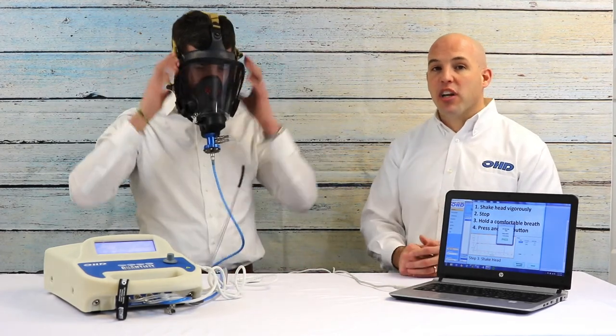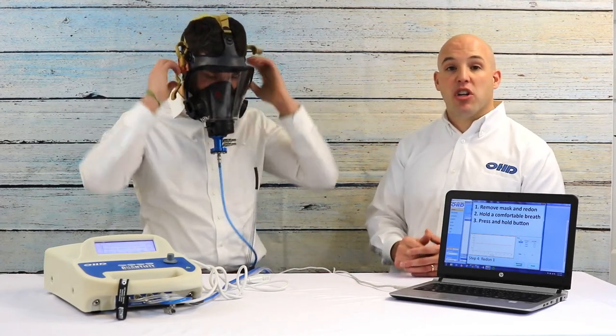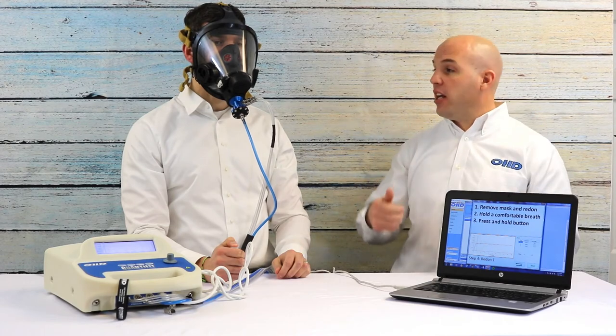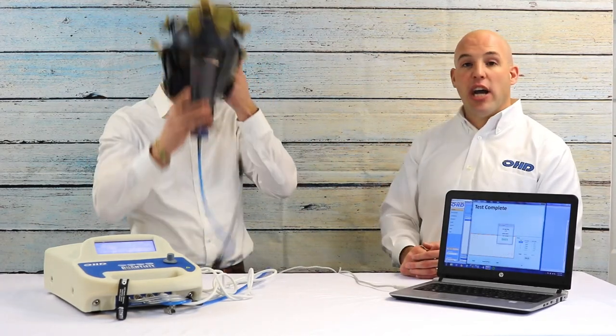Now we're ready for step four, where the Quantifit's testing process becomes really unique. He's actually going to remove and re-don the mask. Research on respirators found that one of the top reasons they leak is that test subjects don't don the mask properly, so step four tests that. He removes the respirator, re-dons it, draws his breath, presses and holds the button, and the Quantifit pulls pressure and searches for leakage. His fifth and final step is once again a remove and re-don, reinforcing proper donning. He re-dons it, faces forward, presses and holds, and that completes the OHD Quantifit fit test.